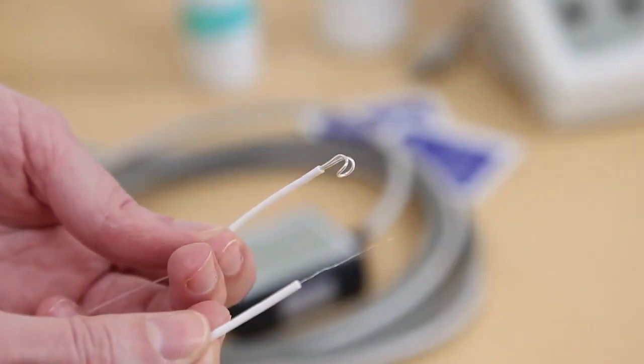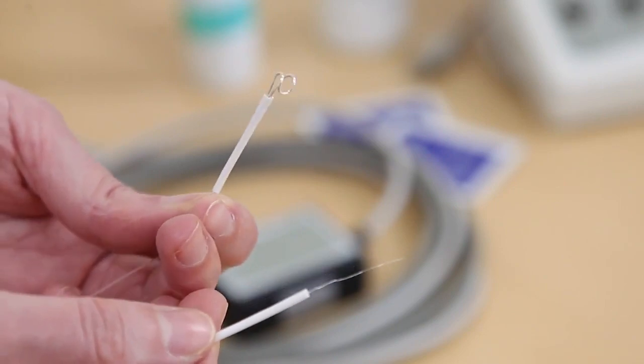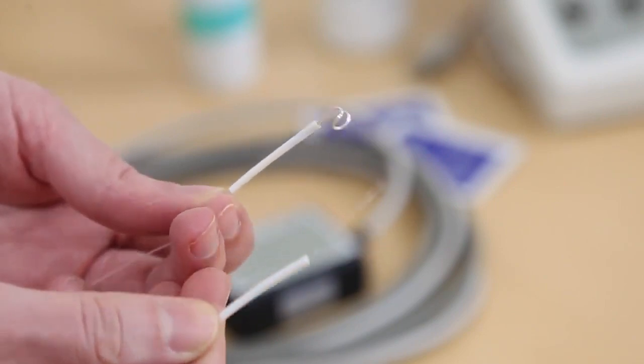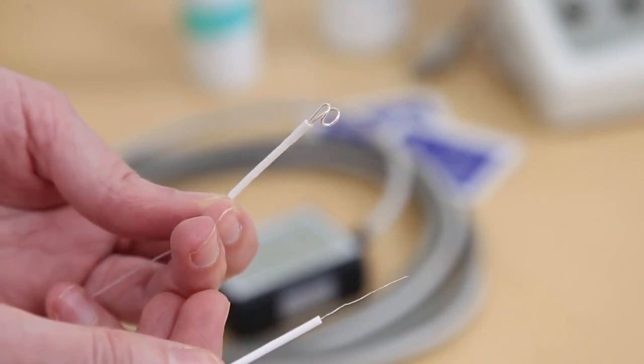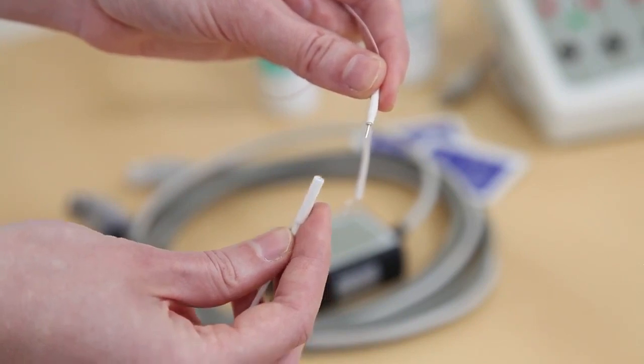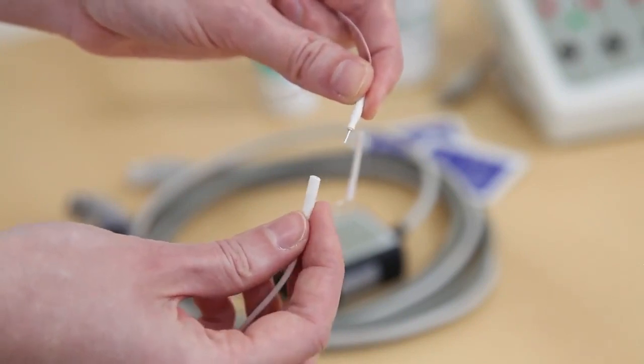Also, we need a corneal contact electrode. We can use either silver-coated, hook-shaped or loop-shaped electrode. Today we are going to use a hook-shaped electrode. The corneal electrode is connected to the device with a special adapter.